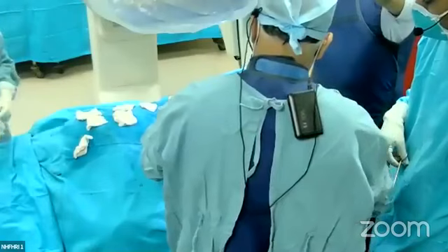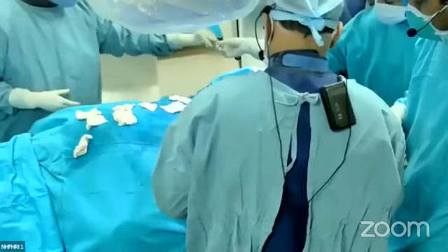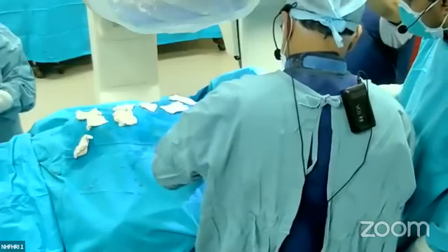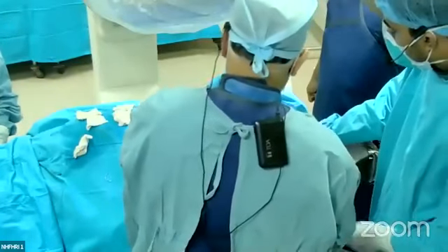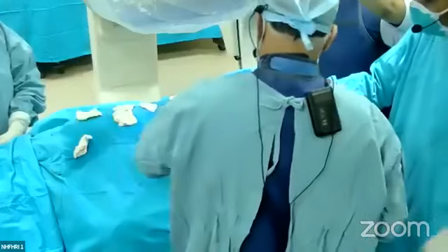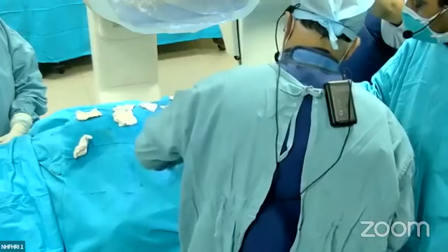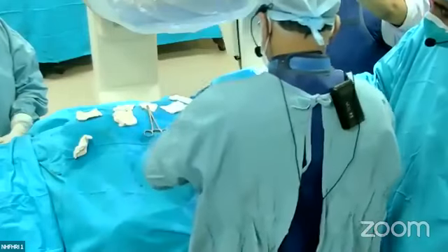And this patient has got atrial fibrillation. We are using the dual chamber pacemaker that is more advanced, that has got an atrial fibrillation suppression mode. All atrial fibrillation starts with atrial ectopics. So as soon as some atrial ectopics are detected by the pacemaker, it will start overdrive pacing, that is anti-tachy pacing, and that will suppress the formation of atrial fibrillation. This pacemaker has this advantage of suppression of paroxysmal atrial fibrillation, but this will not be effective in permanent or chronic atrial fibrillation. And we will start the warfarin after 5 to 7 days when the wound is healed.